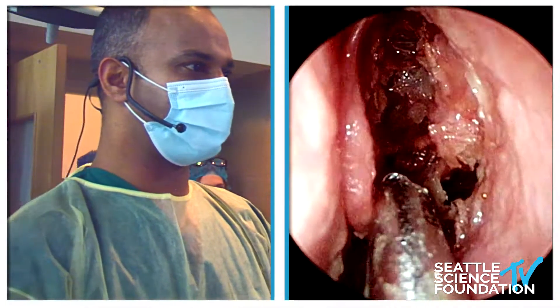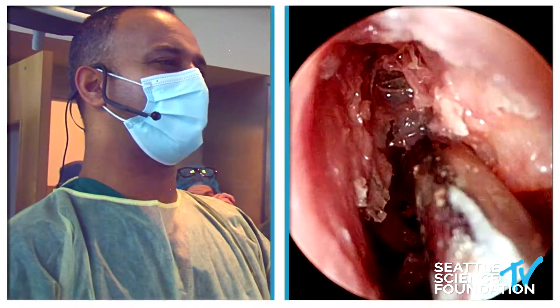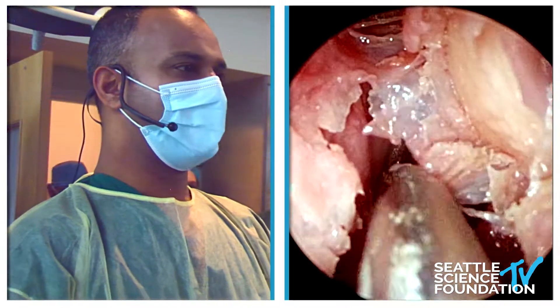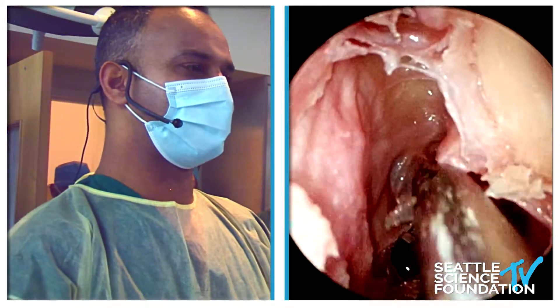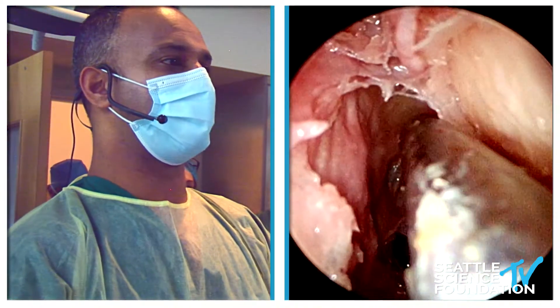In the interest of making complications, what I might do is very quickly clean this one up. Winston has showed us all the anatomy here. What I was talking about — he was saying he could clean this up for us. I'm going to do it very quickly and show us that anatomy. This patient has a little bit more complex frontal sinus anatomy on the opposite side.